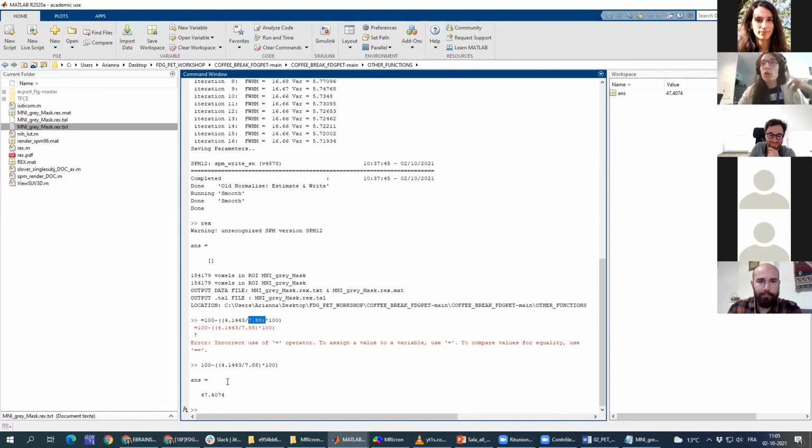So you have your information, and we will see later with GIGA how to interpret these values and show some real clinical cases. So we will talk about this later. We're just going to the technical side now. So this is for the SUV. Are there any questions? Otherwise, I would move on and not do the breakout rooms now, because these are really quick things, and I think you can replicate it yourself by watching this video that will be uploaded on Indico.